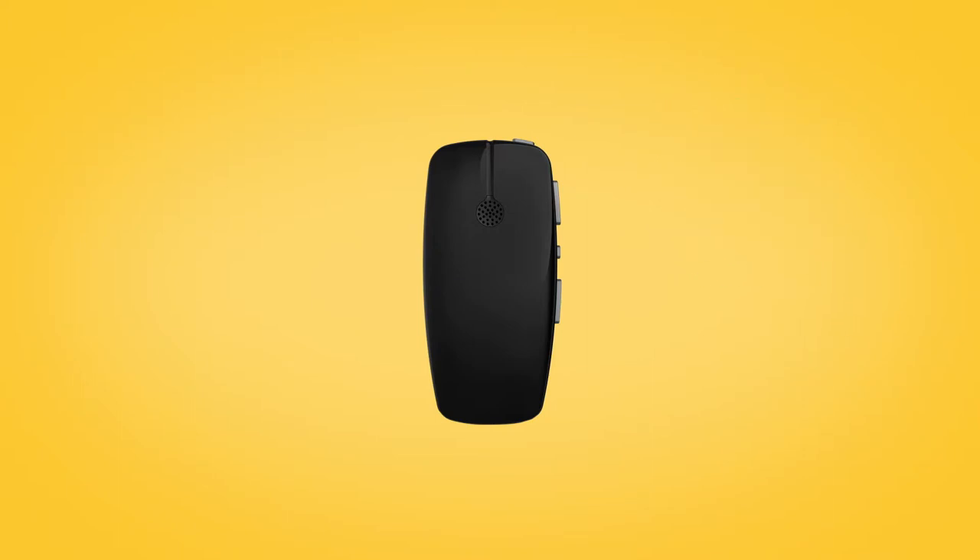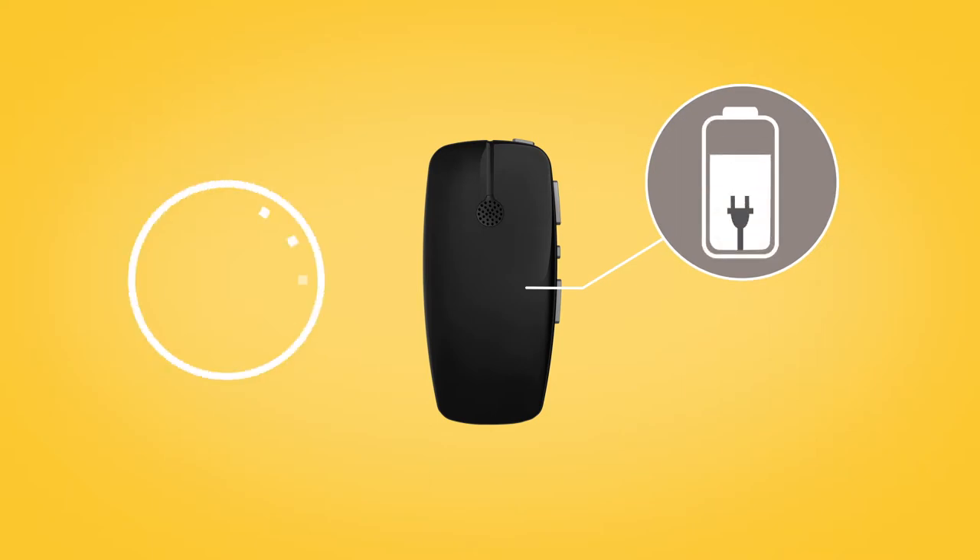Before using your mini microphone for the first time, make sure it has been charged for at least three hours, even if the light indicates a full charge.